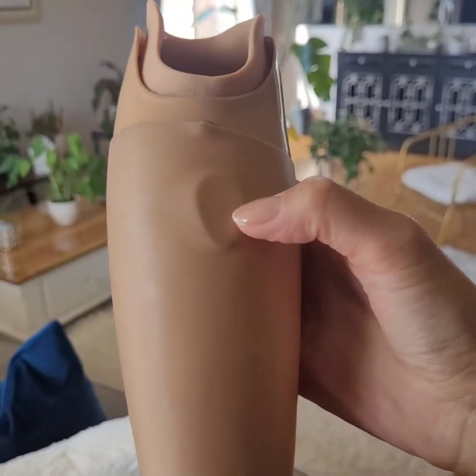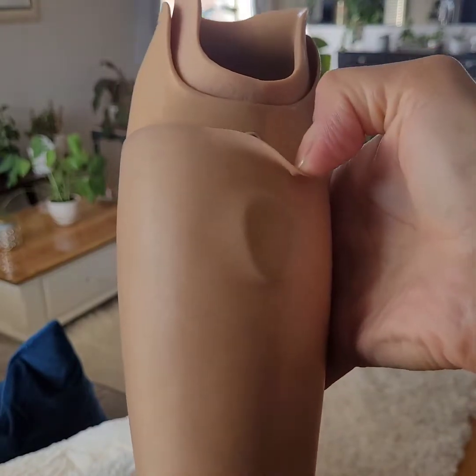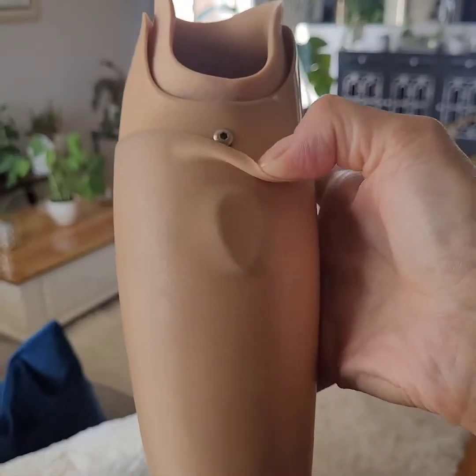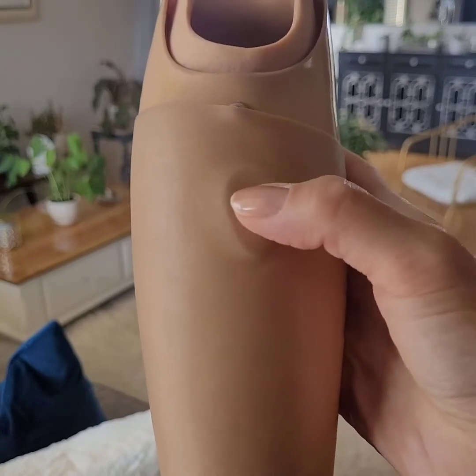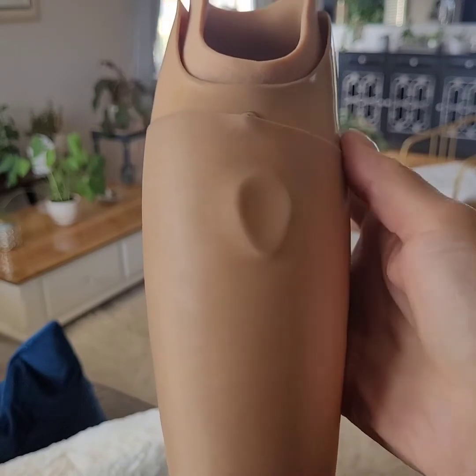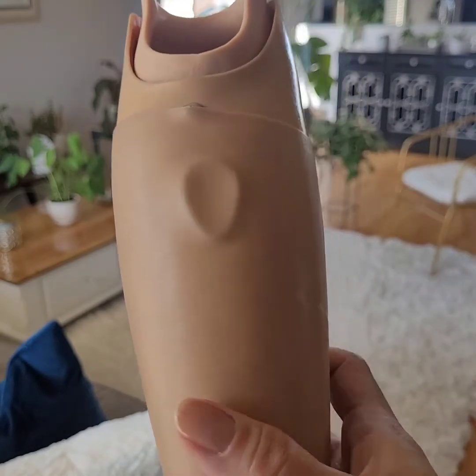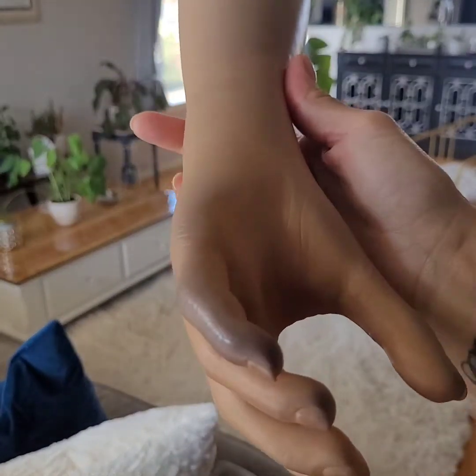This button here is the on and off button. When I peel the glove back — and this glove is extremely hard to maneuver — I peel it back and this is the charging port. I have a charger that I put on here and charge every night so that I'm able to use it.